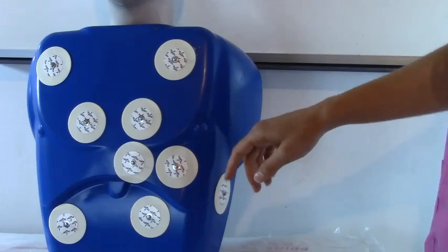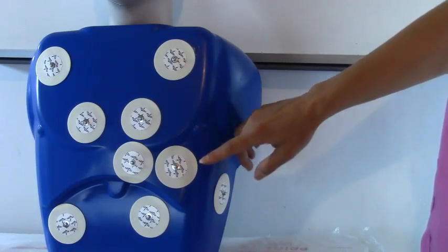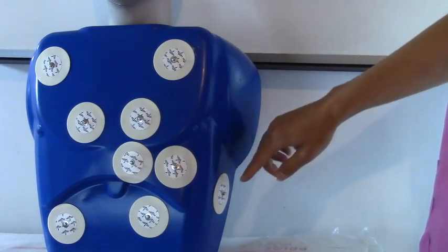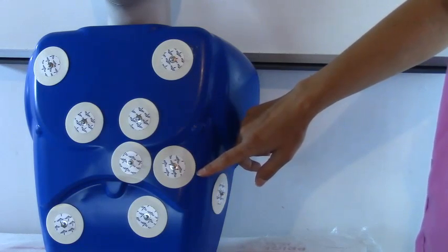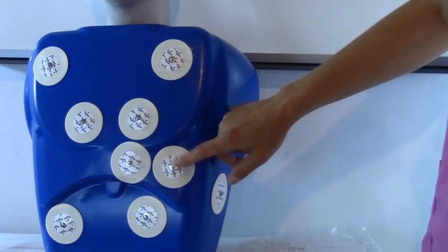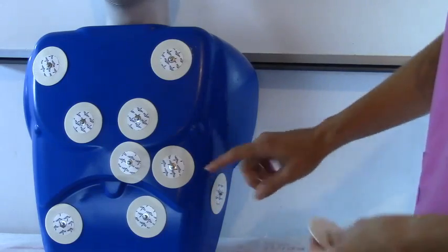And now we're going to go to V5 and this is the anterior axillary line so it's not mid-axillary line like V6 it's anterior axillary line and it's the same level as V4 and V6 so it'll go in between that.